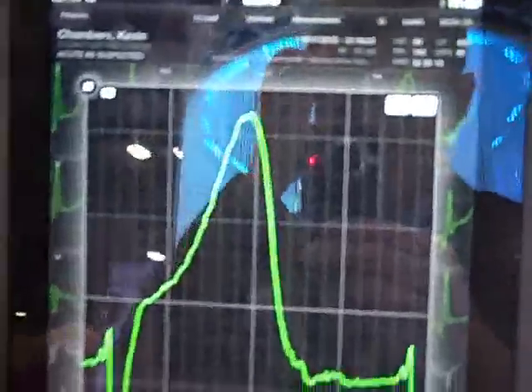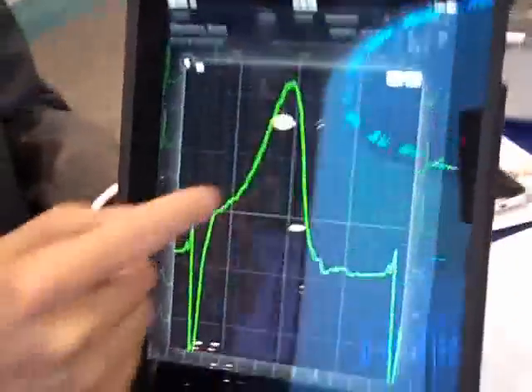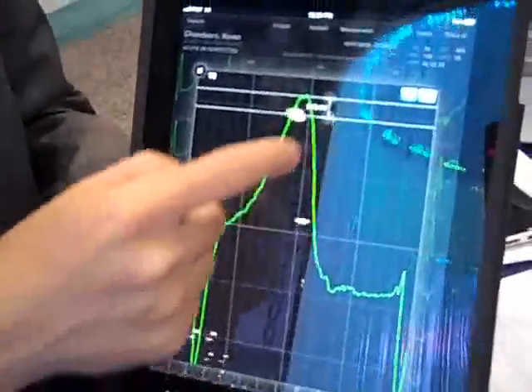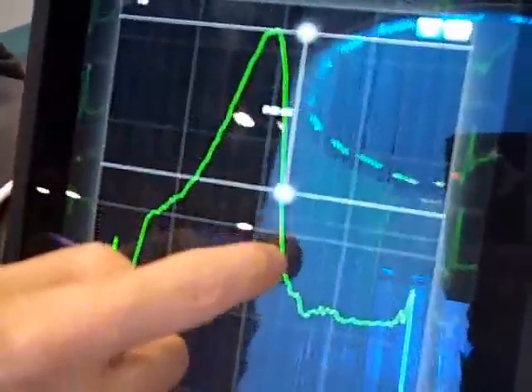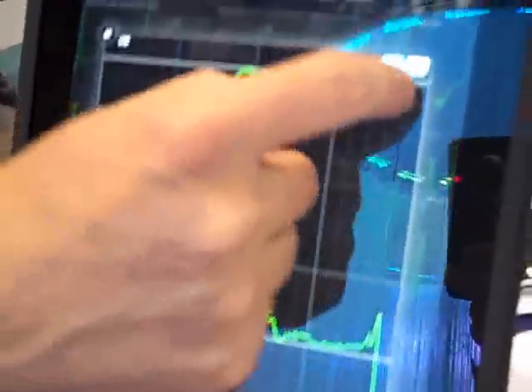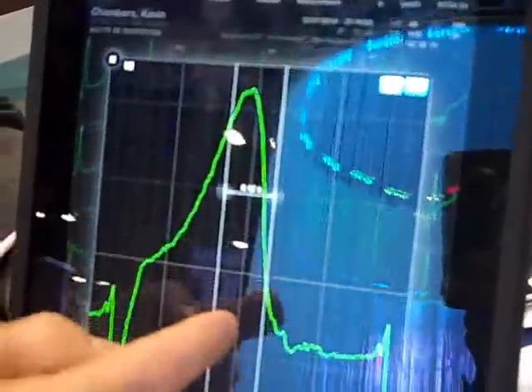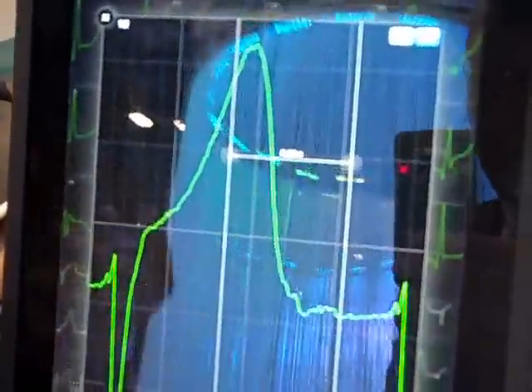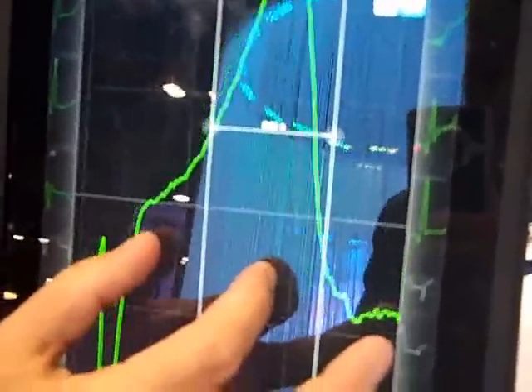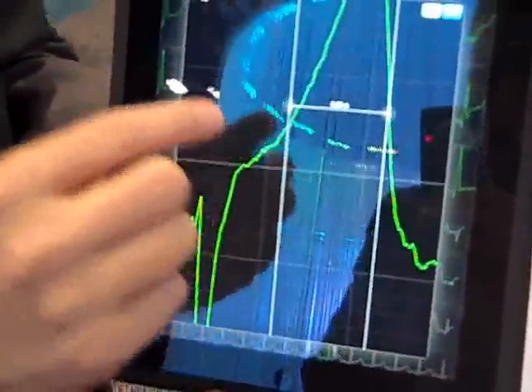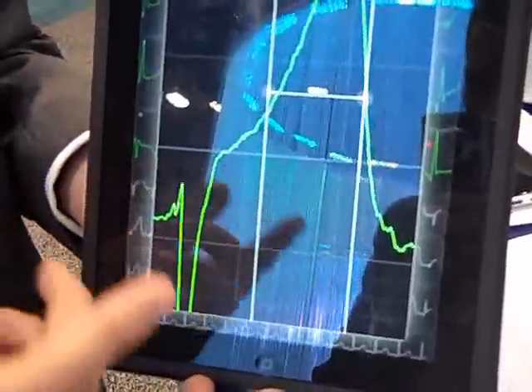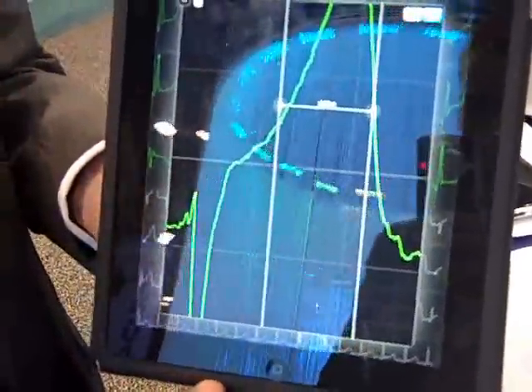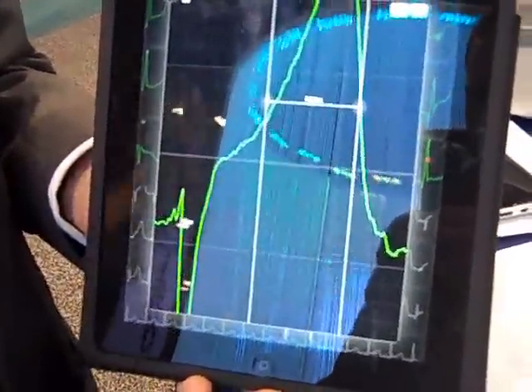If I want to drill into detail on a particular lead or waveform, I have the ability to do further analysis, including measuring the height in millivolts or the distance of a waveform in seconds. As I scroll in, zoom in, zoom out, I can do 20x zoom to look for very subtle changes in ST elevations, for example, in ways that are completely technically impossible to be done today in paper.